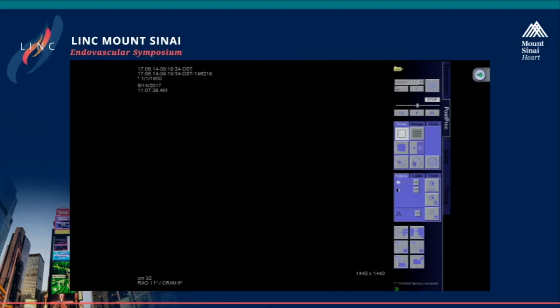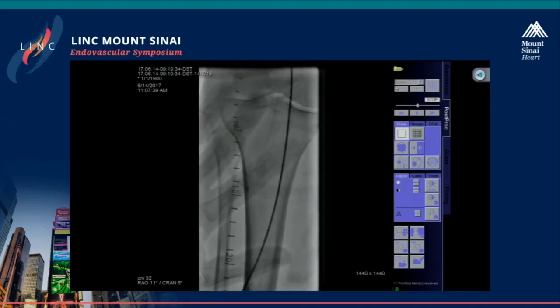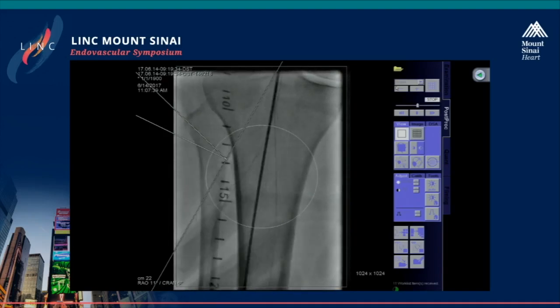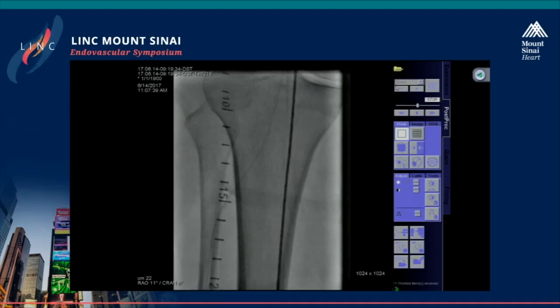But it's your opinion. Do you have the impression that you have some thrombotic material there? And if you have to pass with the atherectomy device, then you have a probability of embolization of the tibialis anterior. I think it's tricky, right? Personally, at this stage, okay, he passed already, so maybe the thrombus is already in the foot.